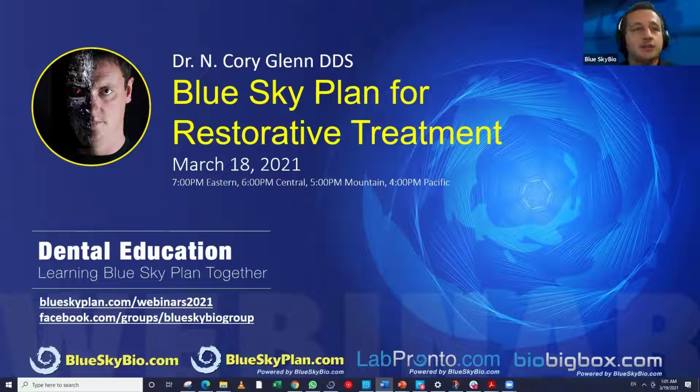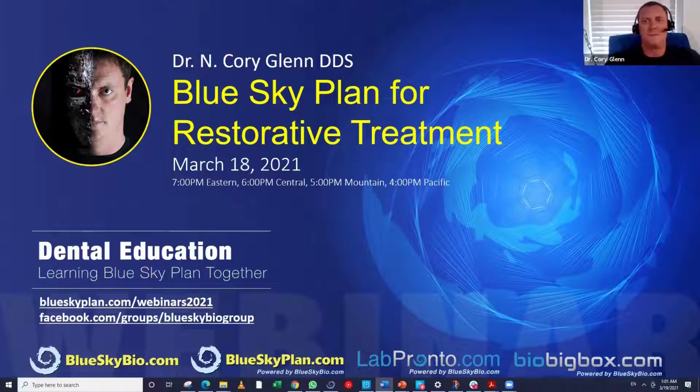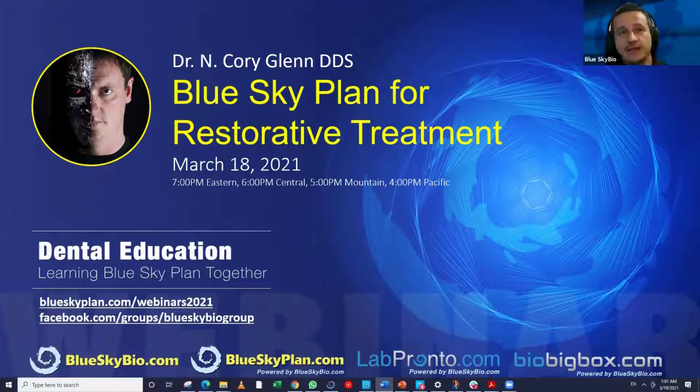We have a lot going on at Blue Sky Bio with Blue Sky Plan. We released a new software build recently with new functionality, new implant catalogs. We did change the surgical guide design process by displaying the undercut model. So just take a look at those videos that we're pushing out. You could see the link in the bottom of the software. It demonstrates and explains the new process. And we are continuing to refine it and optimize it for future releases. But it's important to watch the video so you could see the changes that we made in the surgical guide design process.